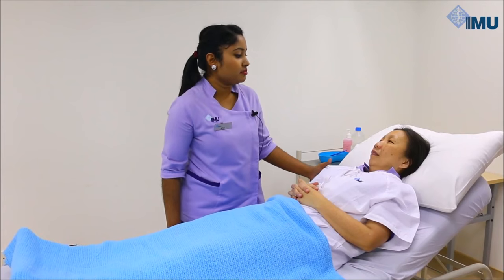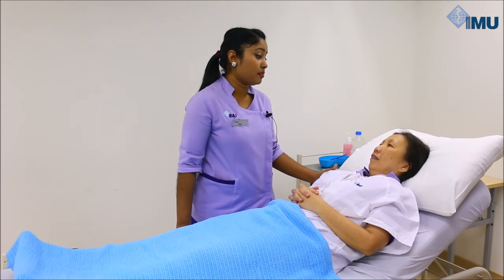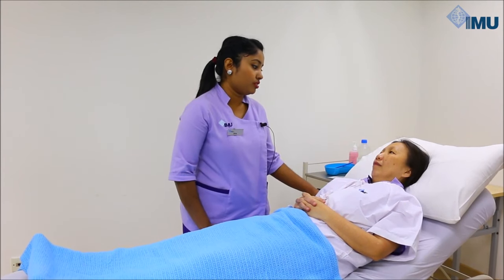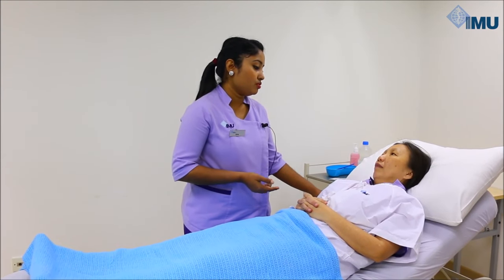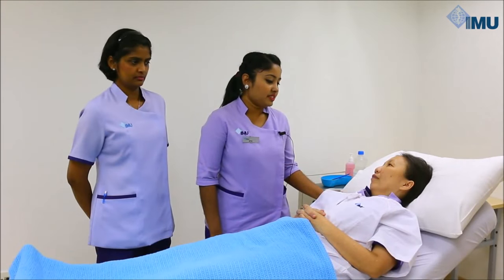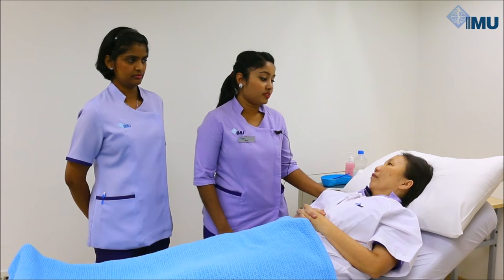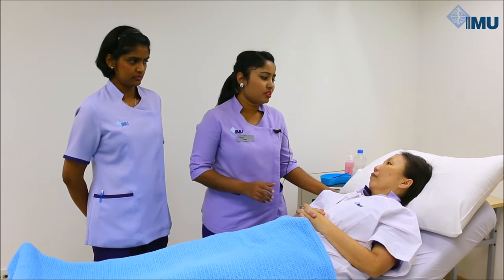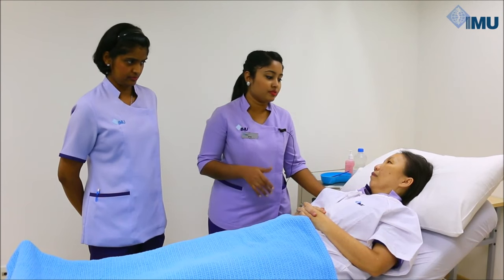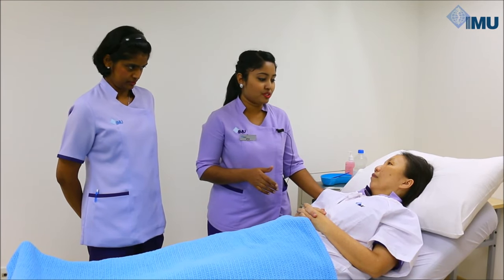The surgeon instructed me to insert a urinary catheter prior to the surgery. Any procedure under spinal anesthesia may cause urinary retention. So today, I'll be inserting a urinary catheter into your bladder. Mrs. Jane, this procedure may cause a bit of discomfort, but it is not a painful procedure. Ms. Joanne will be my chaperone throughout the procedure. May I have your permission to proceed, please?